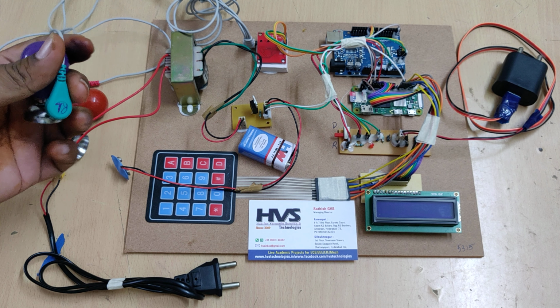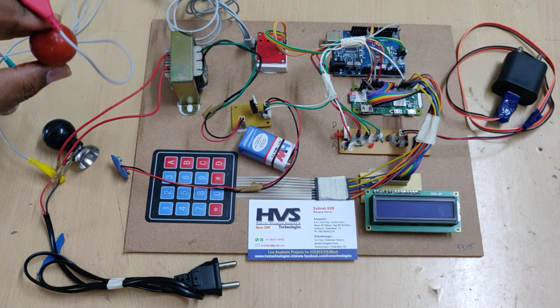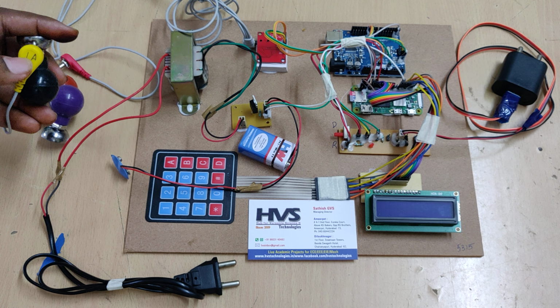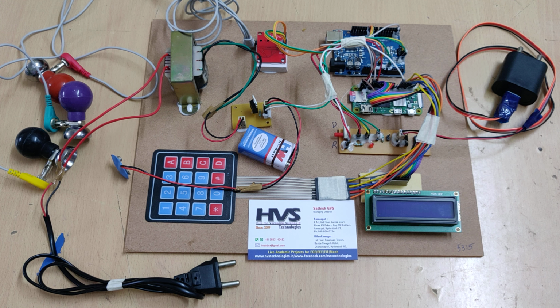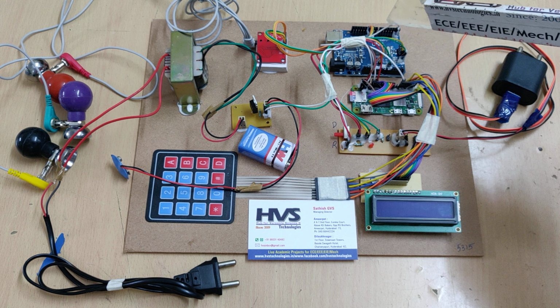Here we wrote RL, which is nothing but the right leg side, the next RA is the right arm, and the next LA is the left arm. So we need to mount these electrodes on the respective locations on your body, and after that the Arduino UNO will capture the data. There are three pins interfaced to the UNO board.